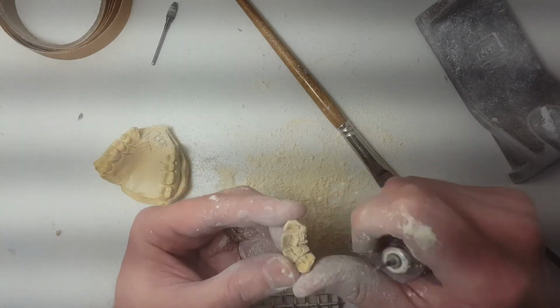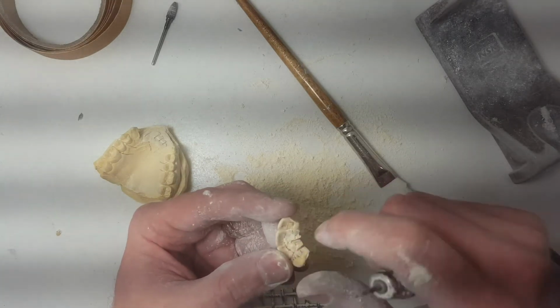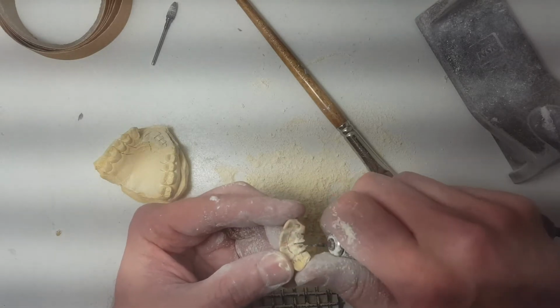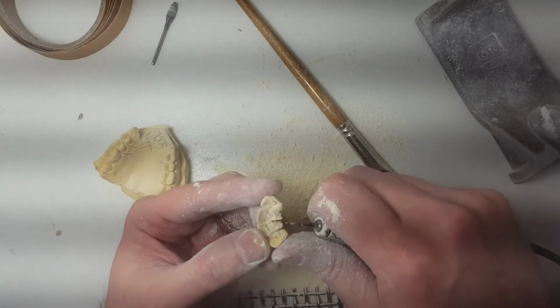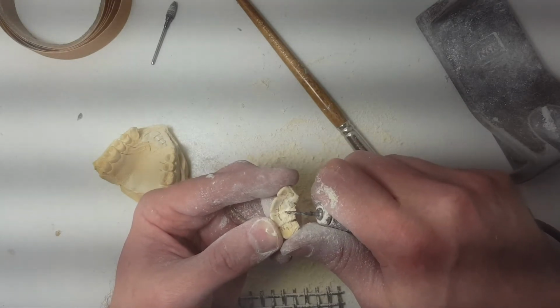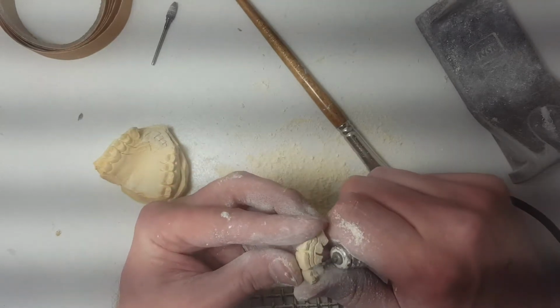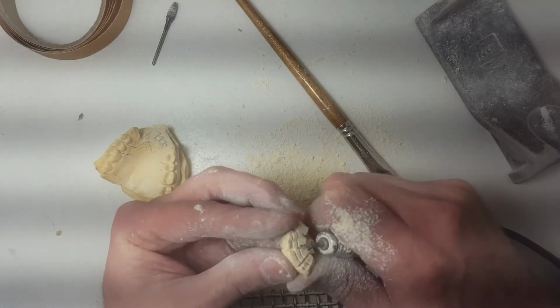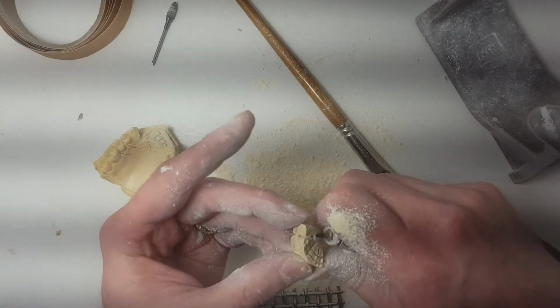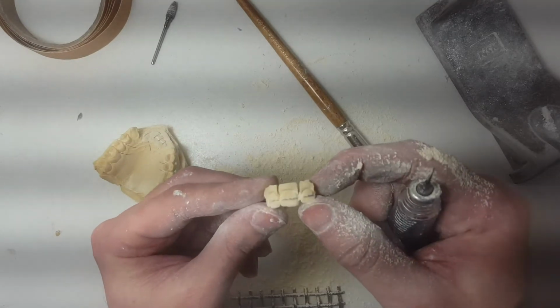Now I'm doing lingual. Now, you gotta keep an eye on that lingual papilla right there, or incisal papilla, that poofed out part that you burn on pizza when you eat. If it's really big, you're gonna have to remember to wax it out. So I'm going to connect the two sides. So I've done the front and the back. So you can see those gaps.